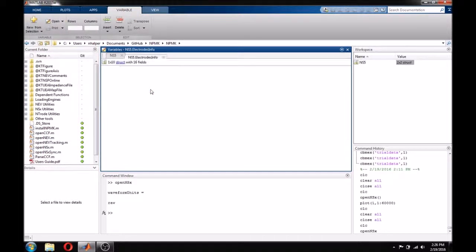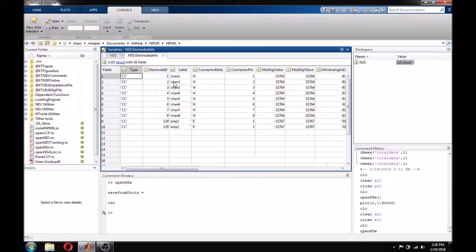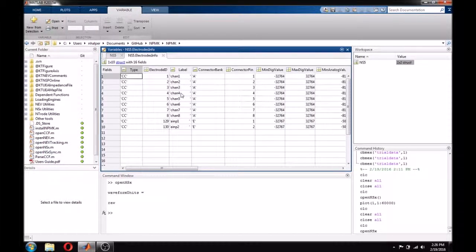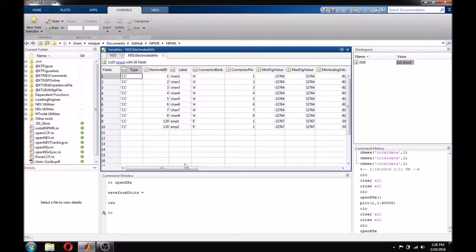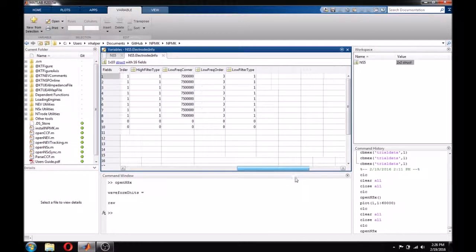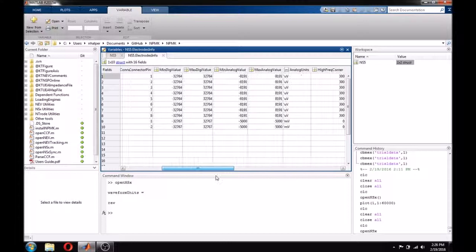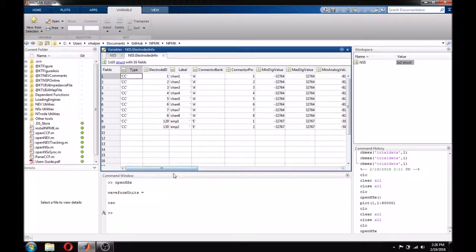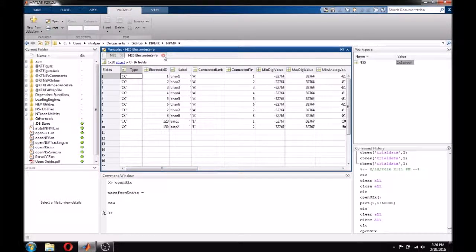Finally, electrodes info contains information about the electrodes. Like the data structure, there is one row in electrodes info for each electrode that was recorded from. This structure contains information such as the label, channel number, and filters.